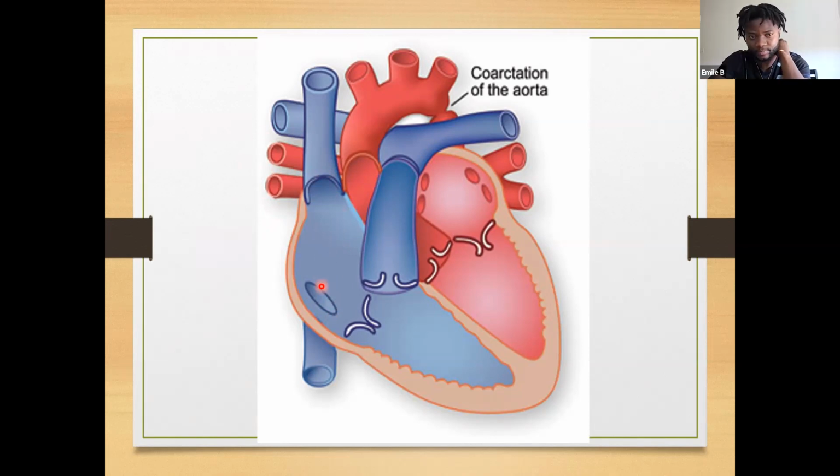The RA is not getting opened, so there is no need. Right. So if you're not opening up the chambers of the heart, it's not necessary to do bicaval cannulation. Just like when you see CABGs happen. CABGs are not technically an open heart procedure. They're working on the top side of the heart.